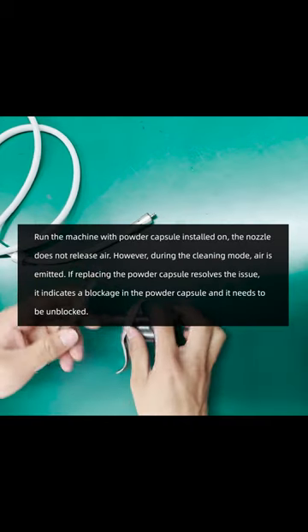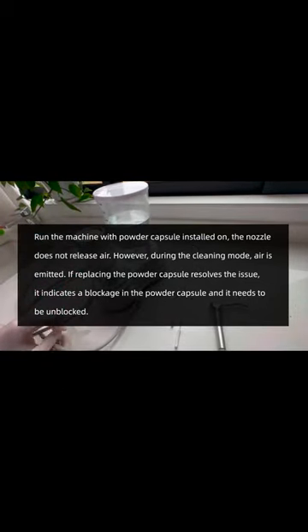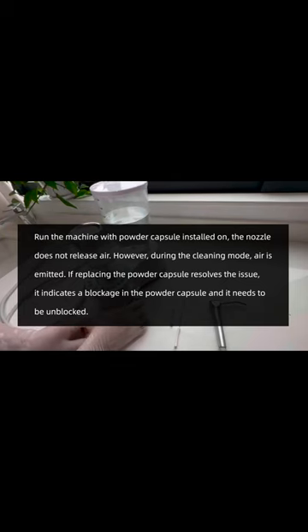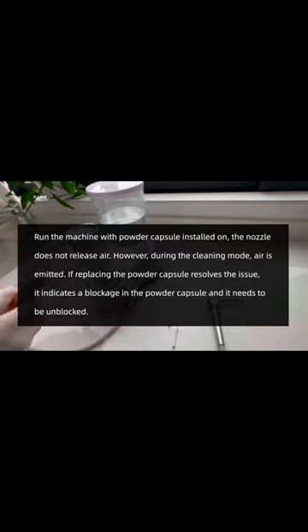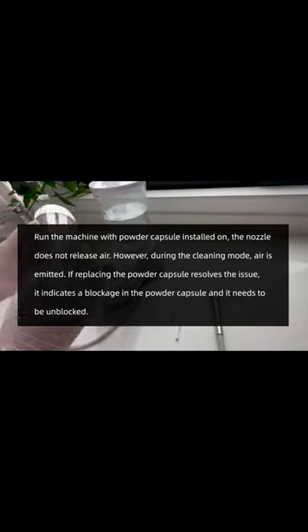Run the device with the powder capsule installed. If the nozzle does not emit air during normal operation, but air is emitted during the cleaning mode, and replacing the powder capsule resolves this issue, it indicates a blockage in the powder capsule and it needs to be unblocked.